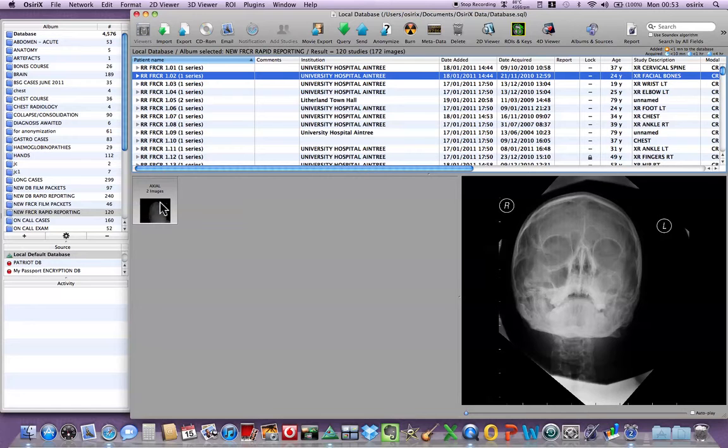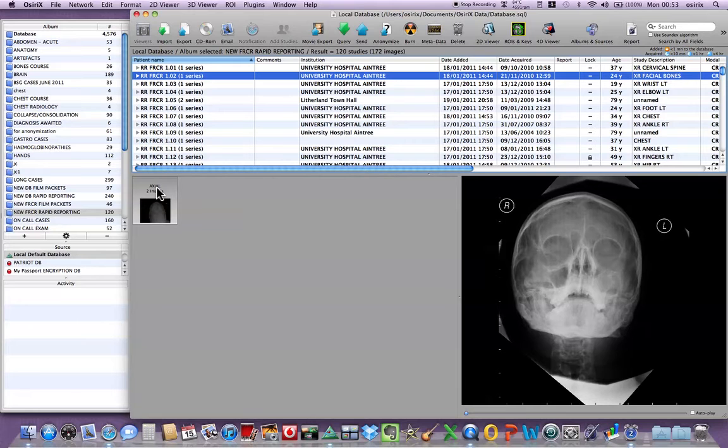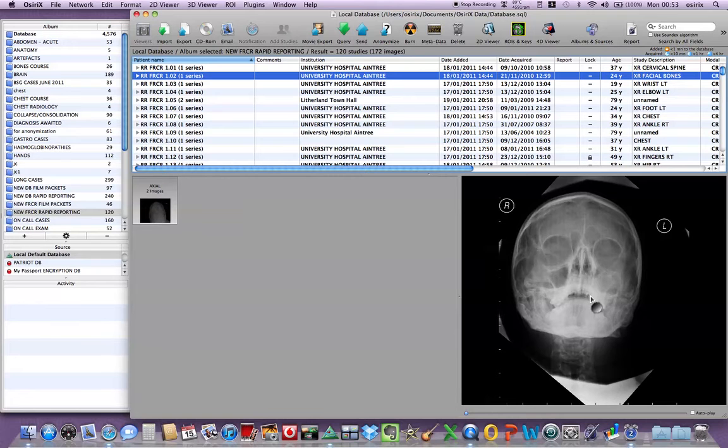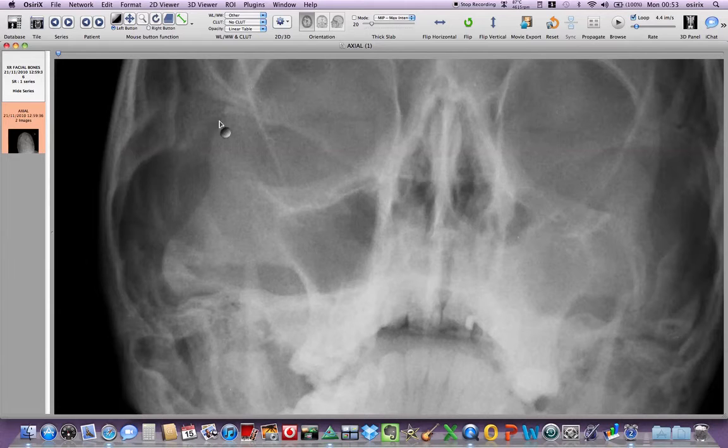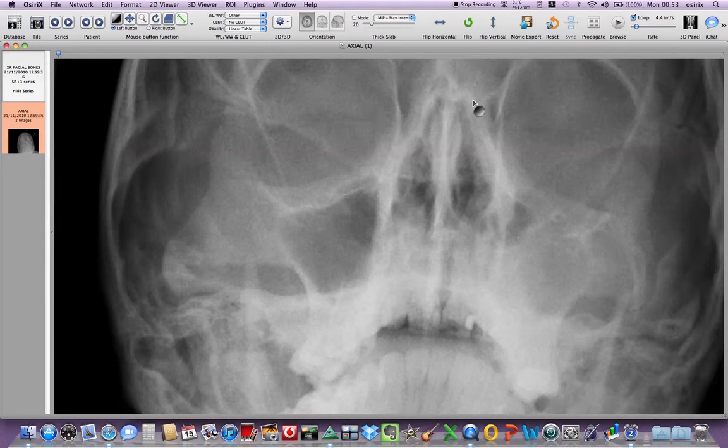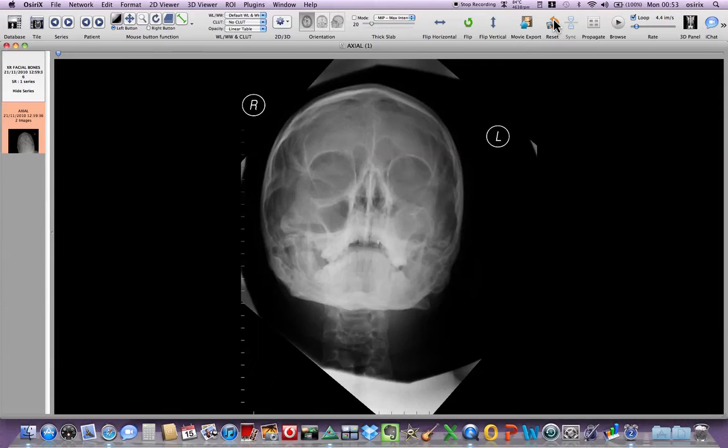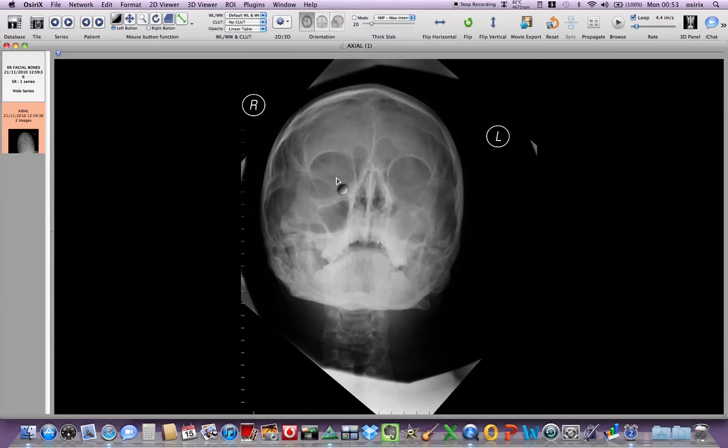The axial images here, the word axial isn't really applicable to this examination but it means we've got two images. So again, double click and I've already magnified the previous image so it's magnified this one. So to go back to the default, press the reset and then I use the scroll bar on the mouse to hover between the two images.